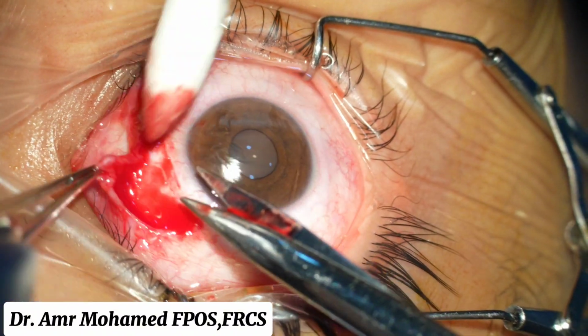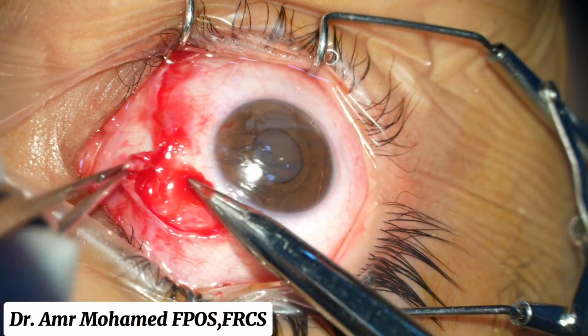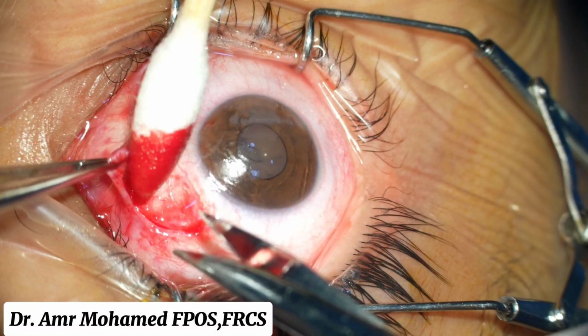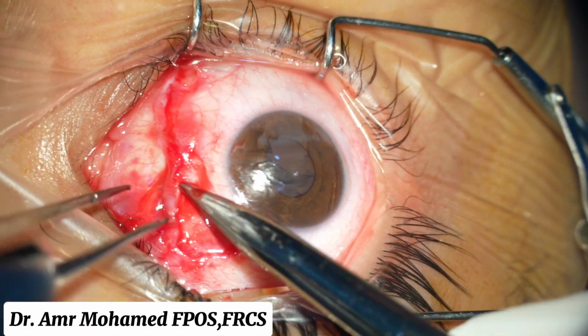Also in such cases there will be more bleeding, and you might need to do cauterization to be able to visualize the tissues properly.